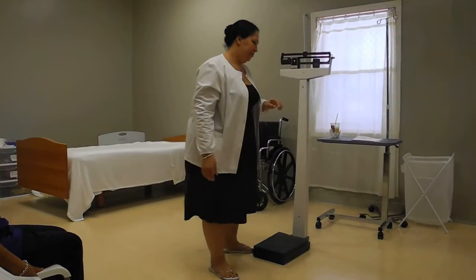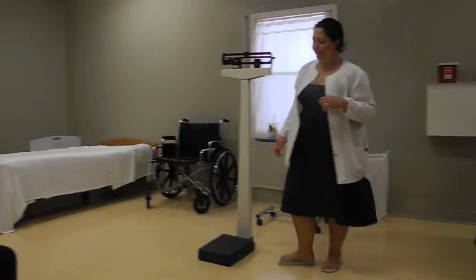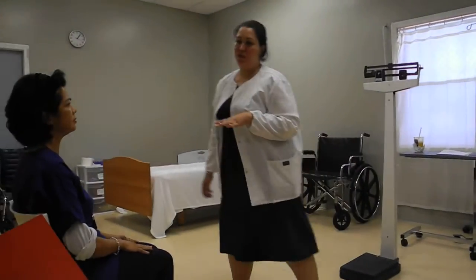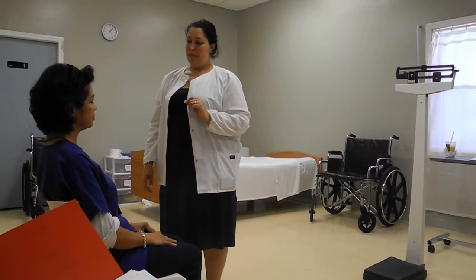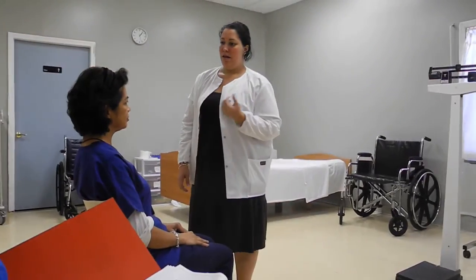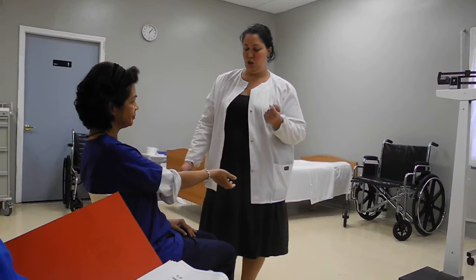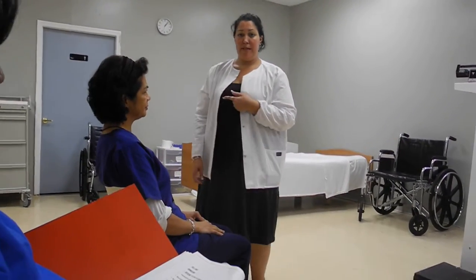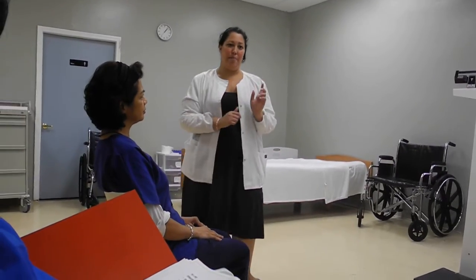So on this scale, there's something very important you need to know. You come in, you introduce yourself. Good morning, good morning. My name is Libby, I'm your CNA today, and I'm going to take your weight. Can I check your ID, please? Okay, Mrs. Jones. Let me wash my hands and I'll be back. You go wash your hands, you put your gloves on and come back.